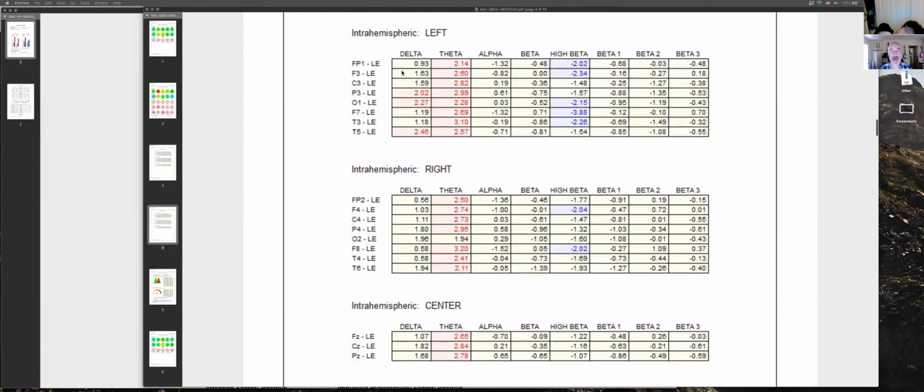Delta: metabolic, sleeping brain waves, deep resting brain waves, keep your heart and lungs moving brain waves, doing some learning and storage of information brain waves. You don't think in delta, you live in it. Your delta is pushed way up. So up, it's pushing into your theta. Your theta is not actually fast, but your delta and your alpha are collapsing the numbers in theta. So delta is pushed up into theta, and the alpha is dropping down and slowing that frequency down essentially.